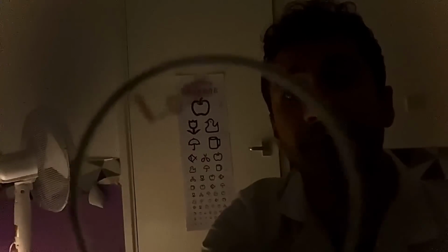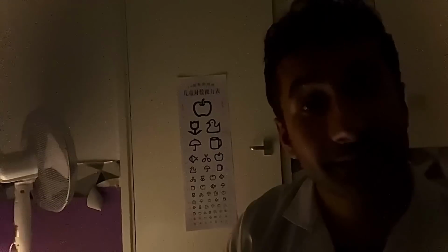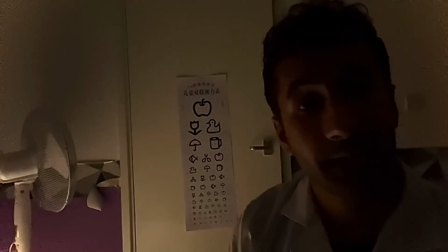I have two cross cylinder lenses here. I have the 0.50 cross cylinder, should we say, and the 0.25 cross cylinder. Now I want you to look at the picture at the top of the chart. Your best lens there at the moment, you should be seeing an apple. Let me know if it's clearer with lens 1 or 2. Okay, that's 1 and that's 2.